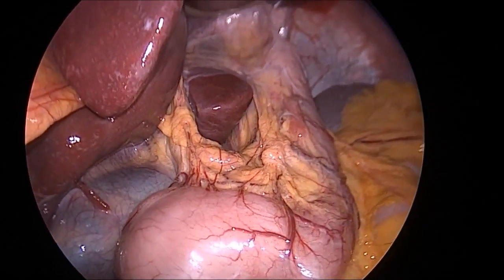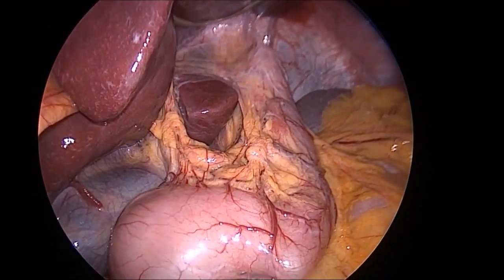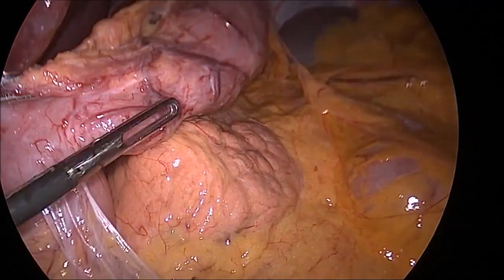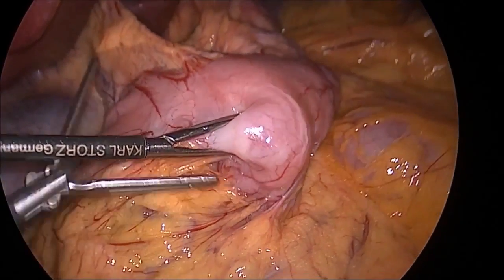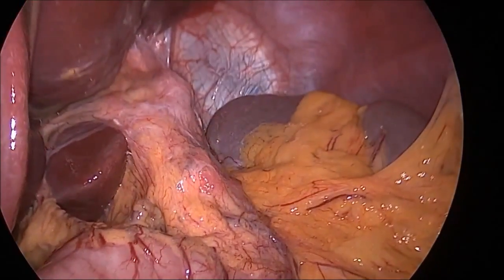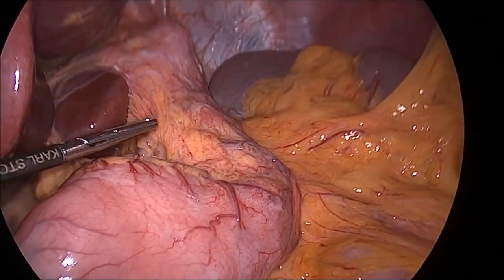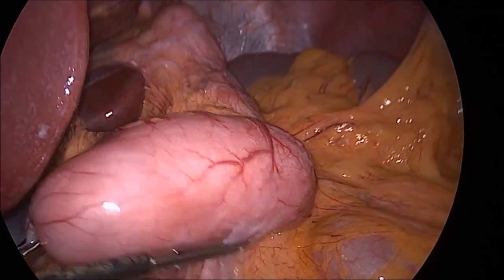The patient was taken to the operating room for diagnostic laparoscopy with possible conversion to a gastric bypass. We inspected the gastric sleeve and it assumed 90-degree angulation. We did not appreciate any adhesions or scar tissue causing external compression at the incisura. We occluded the pylorus and an endoscope was placed relatively easily through the sleeve; however, once we insufflated with air, we realized the sleeve assumes a corkscrew appearance with marked angulation at the incisural level.